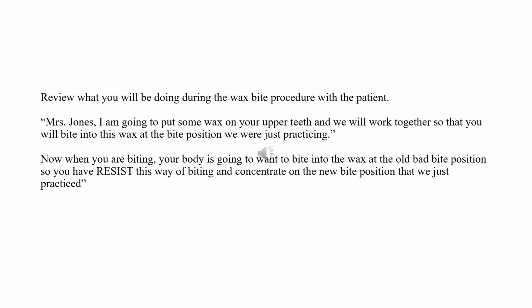So remember, now you're working with a real human being called our patient, and you don't want to be derogatory. Don't say degrading comments. Always say positive comments. You want to first review what you'll be doing during the wax bite procedure with the patient. So Mrs. Jones, I'm going to put a piece of wax on your upper teeth, and then you're going to bite up and down.